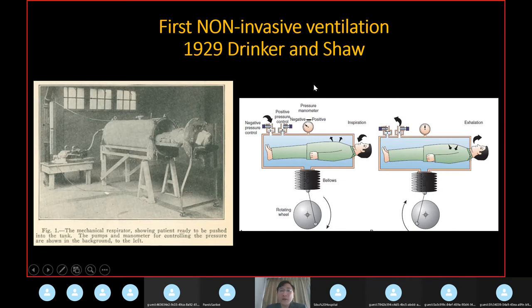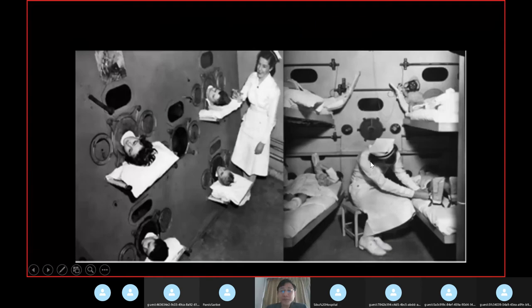And this negative pressure ventilation is not suitable for patients who have a lot of problems of primary lung pathology, like pneumonia, because this pressure might not generate enough pressure to inhale the gas. Also, if the patient has significant secretion or pseudo-bulbar palsy or is unable to maintain the airway, this mechanism is not the appropriate way to go.